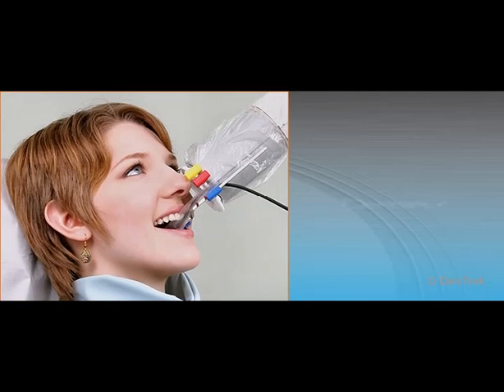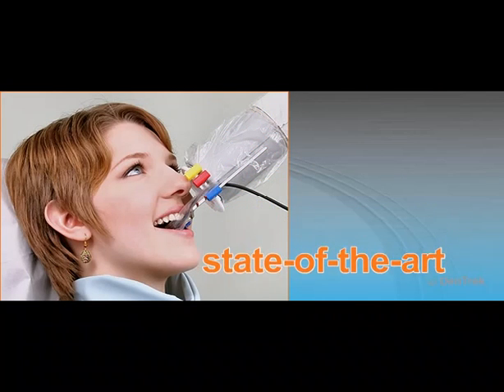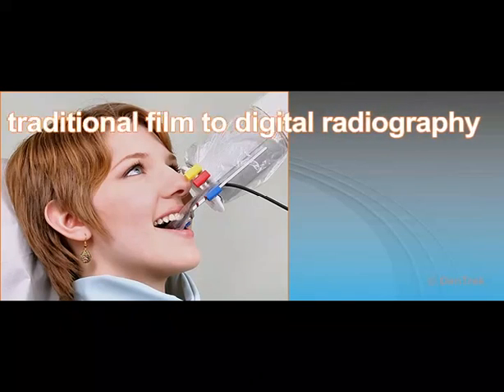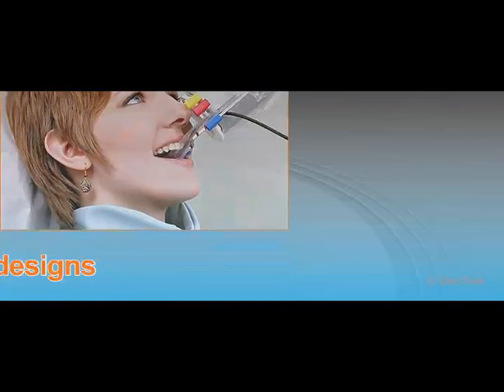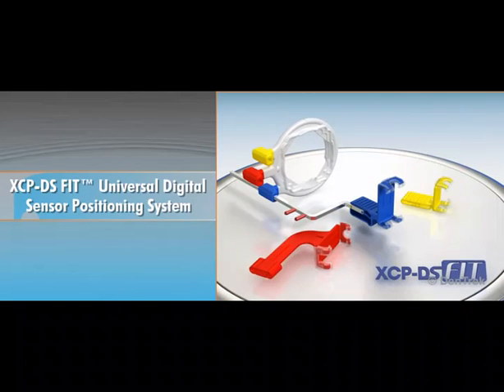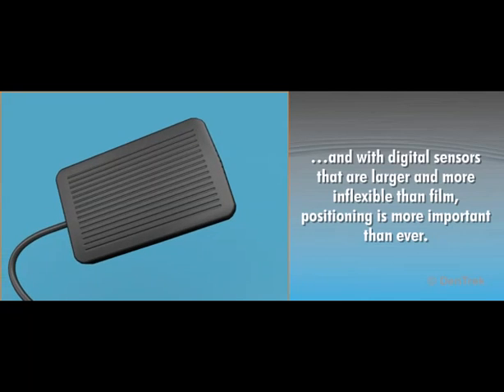For more than five decades, Dentsply REN's XCP film holding system has represented the state of the art in dental radiography. However, as the dental industry transitions from traditional film to digital radiography, conventional film holding systems are changing to newer, more advanced designs, like the Dentsply REN's XCP-DS-FIT universal digital sensor positioning system. And with digital sensors that are larger and more inflexible than film, positioning is more important than ever.